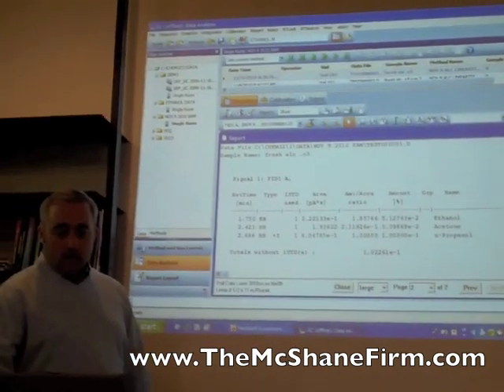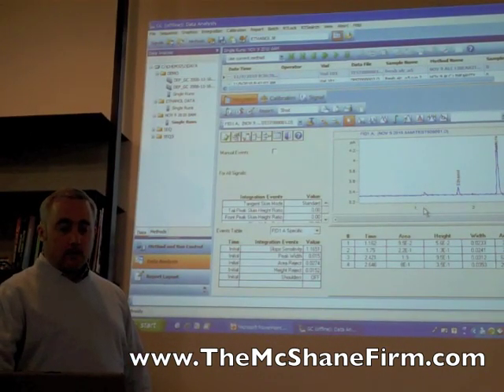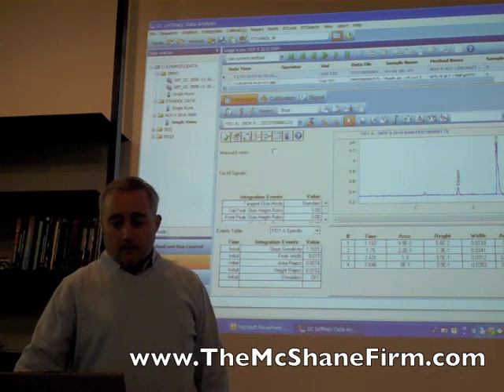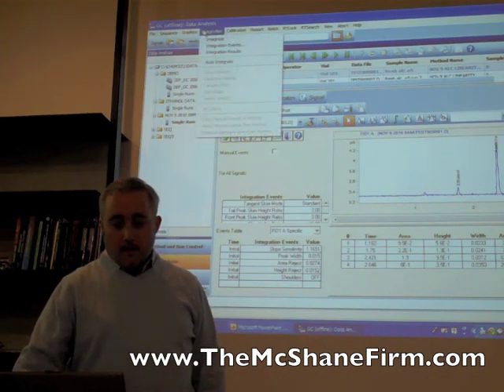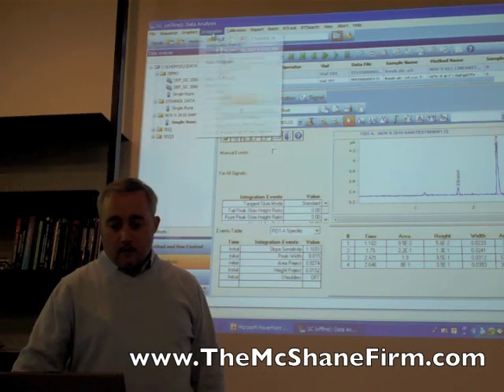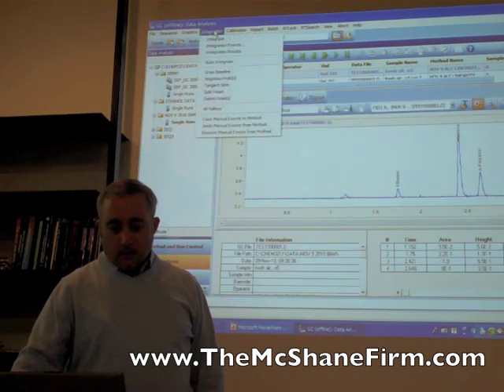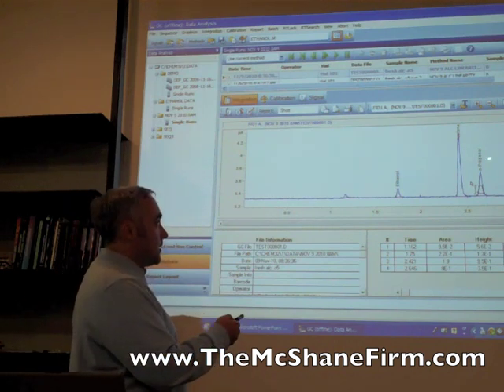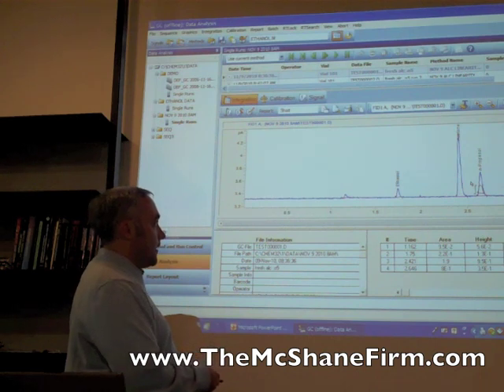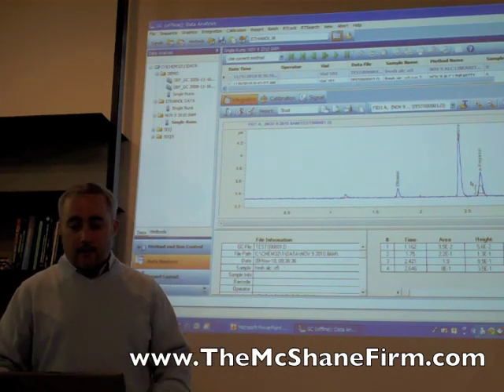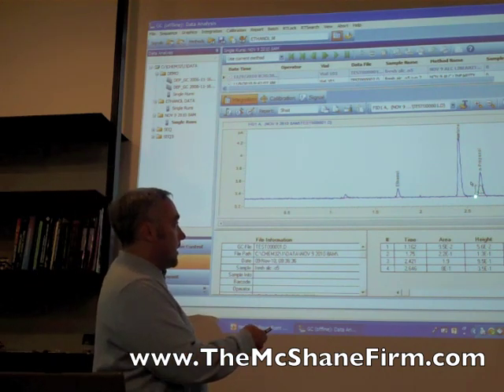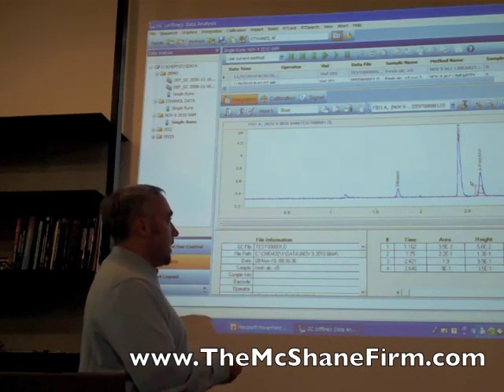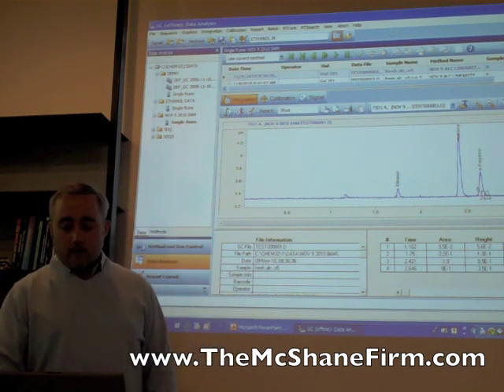The first thing you'd do if you wanted to monkey around with the result and raise someone's BAC is go to the graphical user interface on the raw data and go to Integration, then Draw Baseline. The way the internal standard works is: less area of the n-propanol results in a higher calculation of the ethanol — it's inversely proportional. So what you do is move the baseline up, which calculates less area under the n-propanol peak, meaning the ethanol result must be higher.